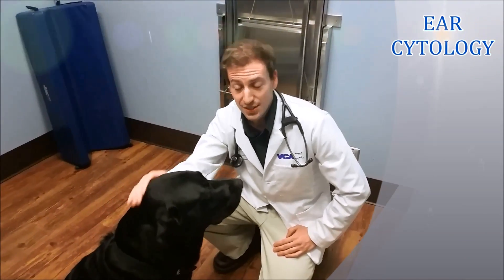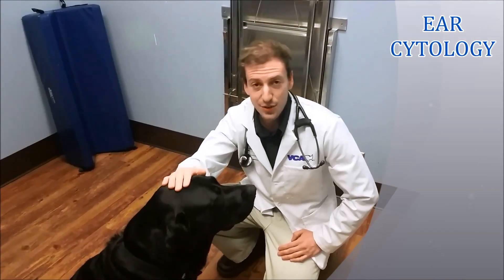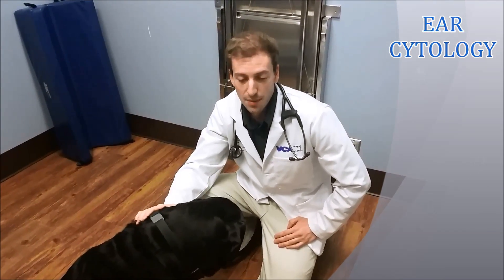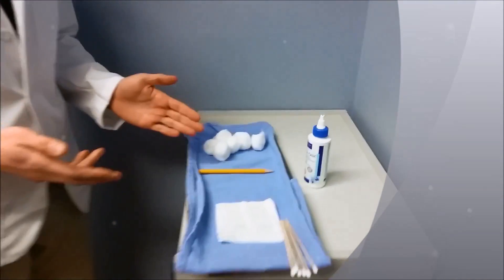I'm Dr. Seifkin — you probably know me — and I have Henry Bernard here. We are going to be performing an ear cytology swab, and I'll have Camille, our camera lady, focus in over here on what we have.